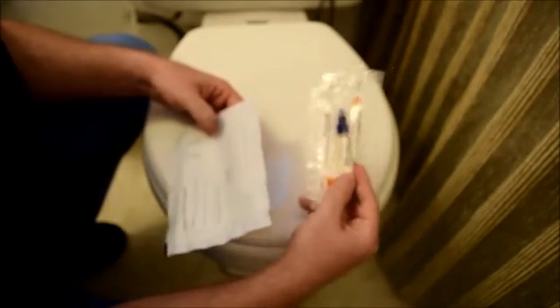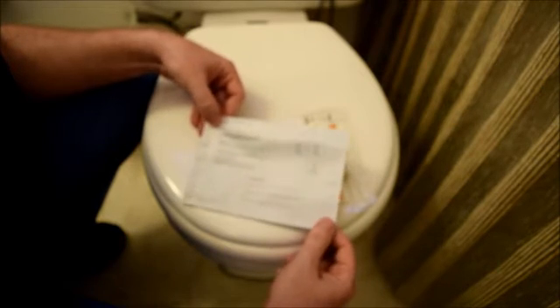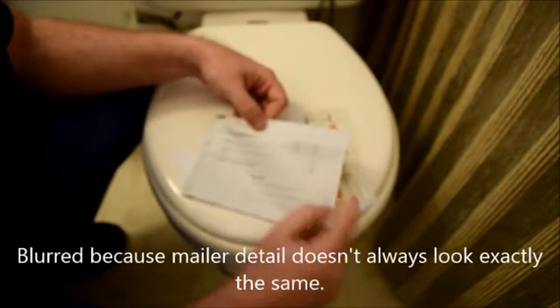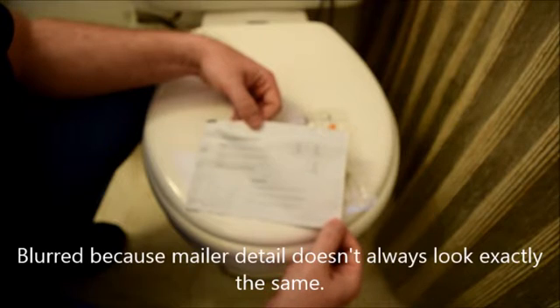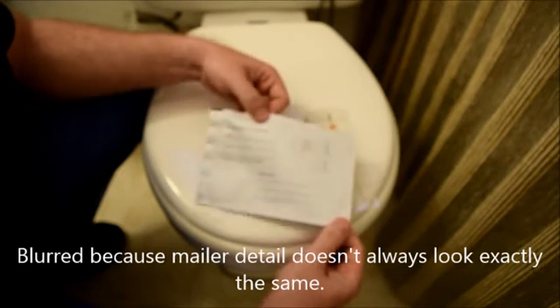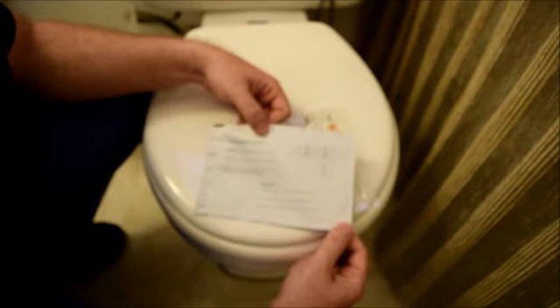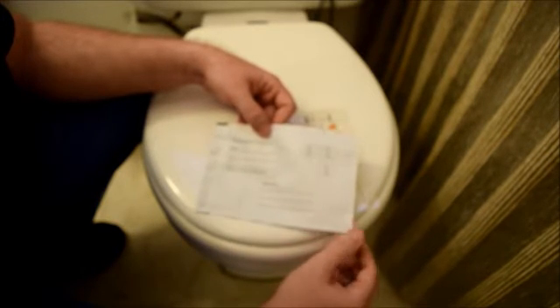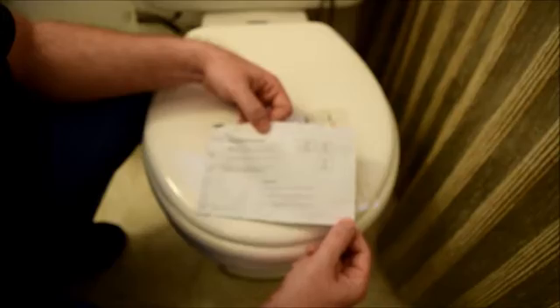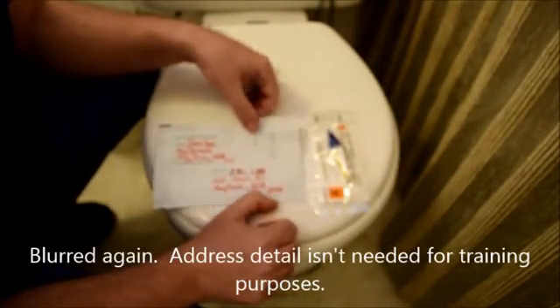If, for whatever reason, you cannot return this to your physician or lab in person, you can use the mailer that was provided to you. It's important to note that the squares for stamps are not representative of how much the postage actually costs. Please, if you're going to mail the sample instead of taking it back to your physician or lab in person, go to your local post office and apply the proper postage. This is very important.